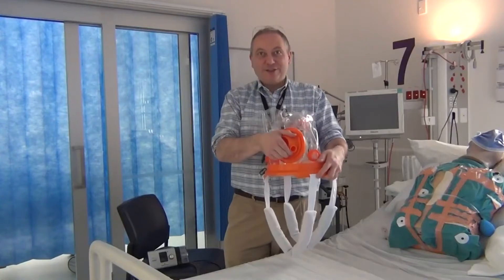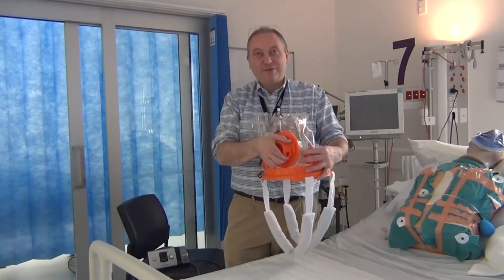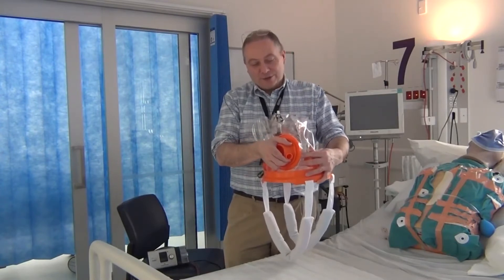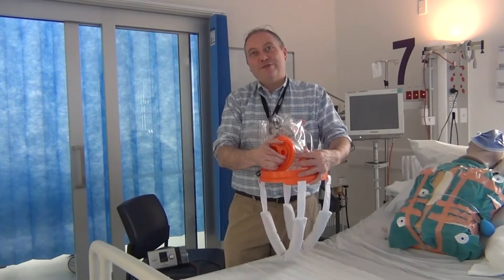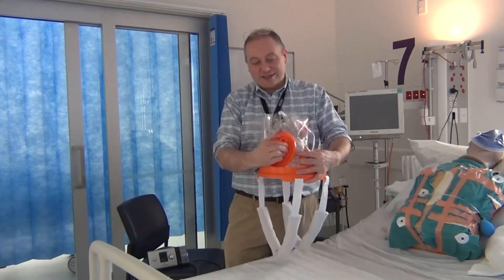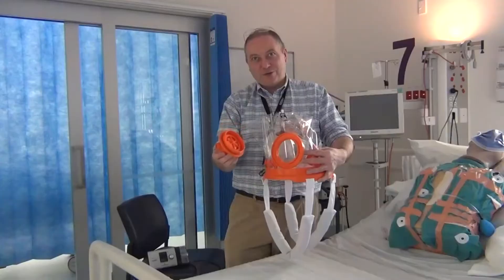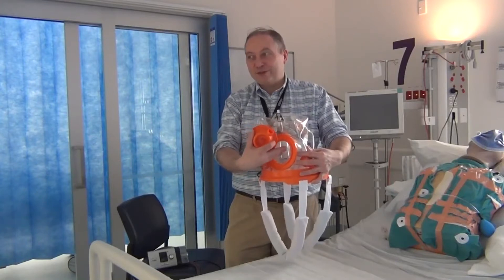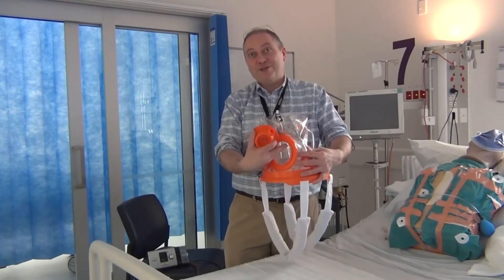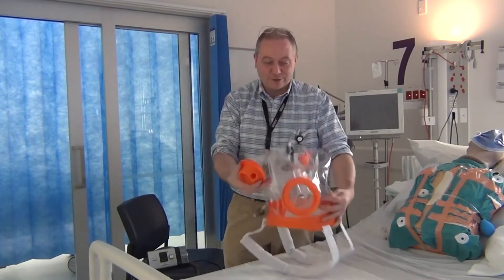The next feature is the free breathe valve. This serves several different functions. Most importantly, if the patient starts to feel very claustrophobic or feels that they're going to be sick and you need to get access to the patient without taking the hood off, you can spin this and remove it. You now have free access into the patient's face. You can put a suction catheter or a Yankauer in to deal with any secretions or nausea and vomiting.